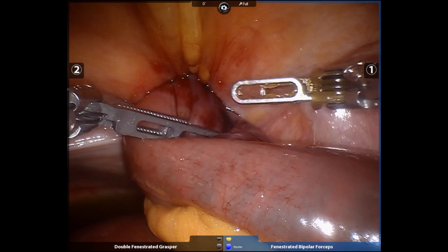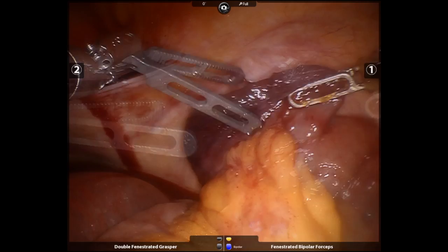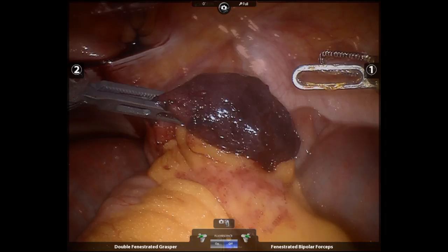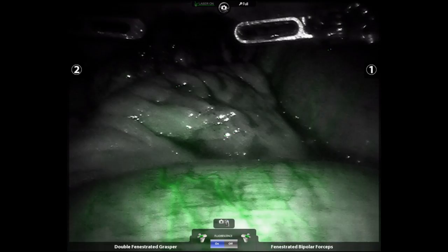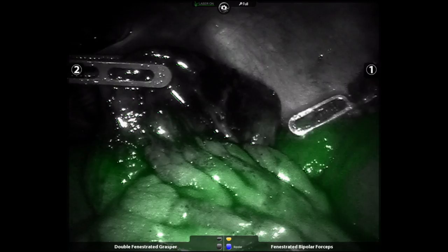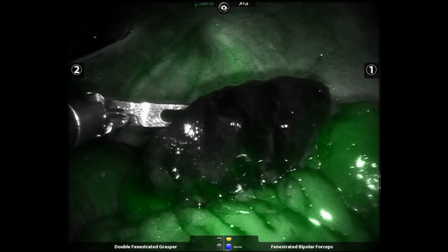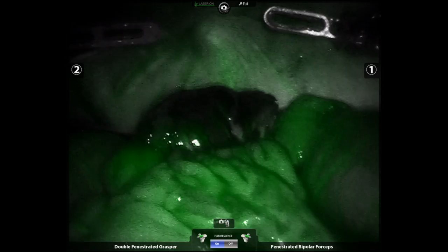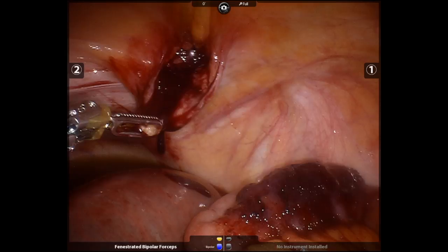The bowel is ultimately reduced. At this point, we request anesthesia to inject 5 cc's of indocyanine green. This clearly reveals a necrotic segment of small bowel. In strangulated cases such as these requiring bowel resection, I elect for a staged repair of the femoral hernia. A portion of the sac is reduced and will be used as a patch to decrease the risk of immediate recurrence.